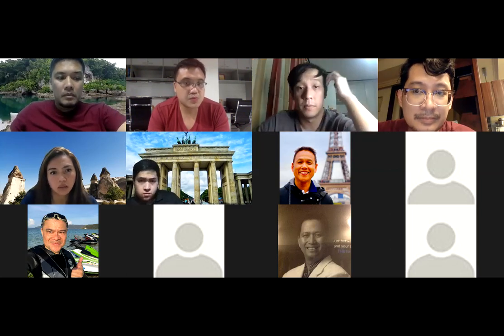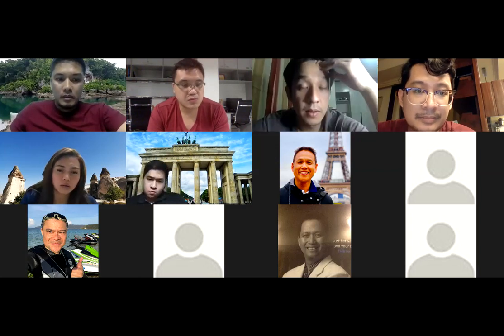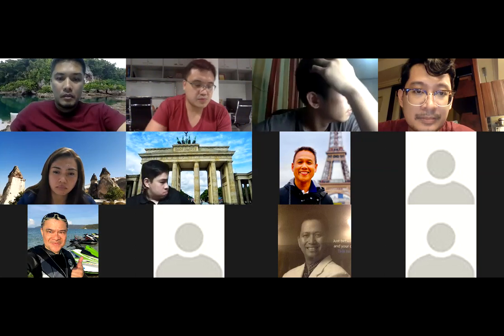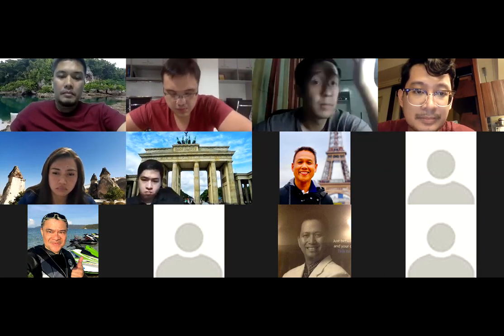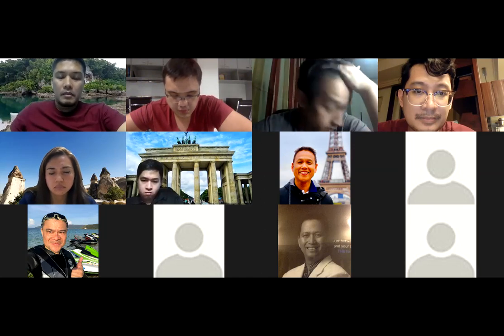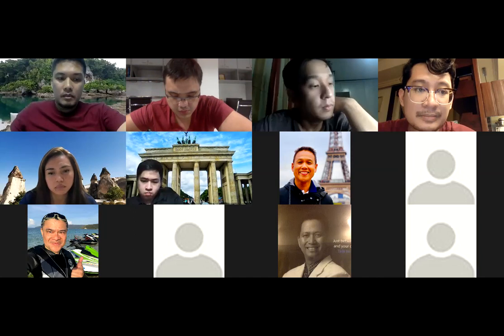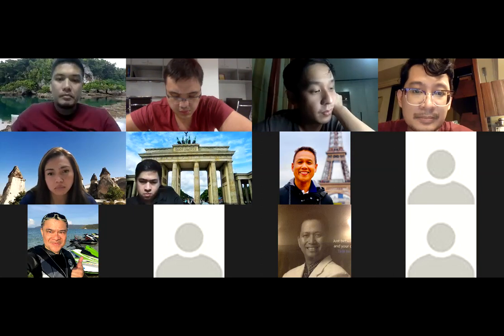Kasama doon, syempre, balik tayo sa basic, history, PE, ano yung medications na tinitake niya, etc. Tapos, importante, minsan hindi mo na kailangan mag-urodynamics, bladder diary pa lang, pwede na, kasi marami ka ng information na makukuha doon. Tanong ko sa iyo, ano pa yung mga information na pwede pang makuha sa voiding diary?